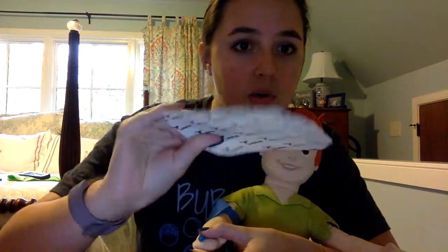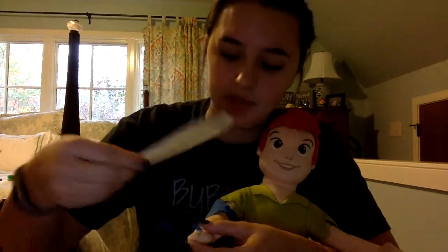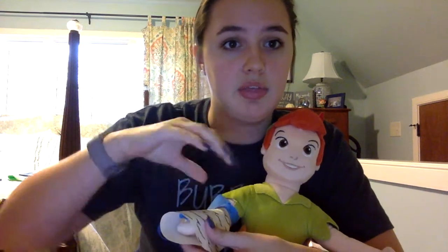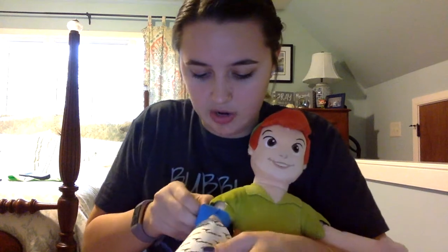So this is an example of one of the Band-Aids that they'll put on. This one's really big and way too big for Peter, but they'll put a little band to make sure that the IV stays in. And then the nurse will take off this rubber band and you'll be all done.